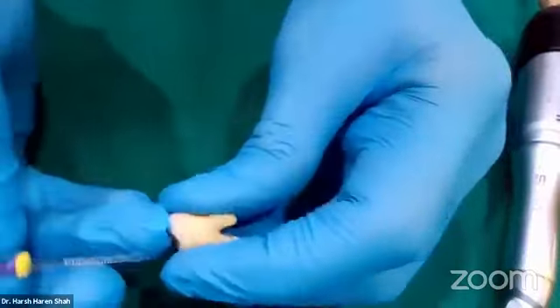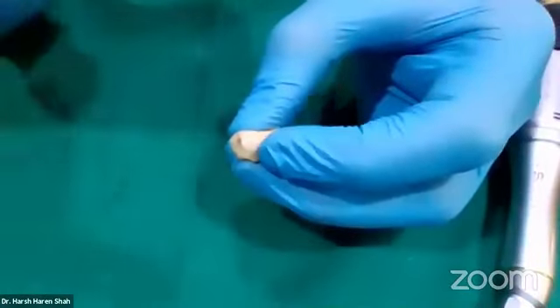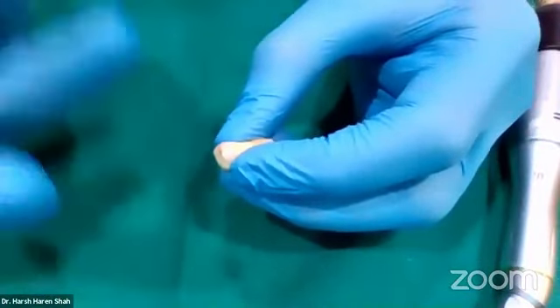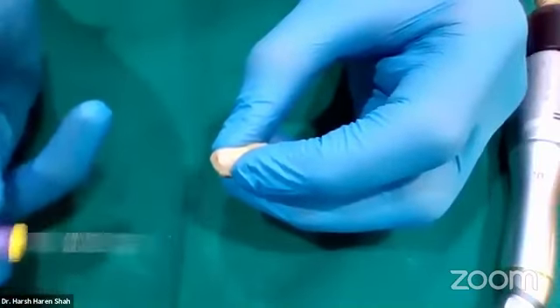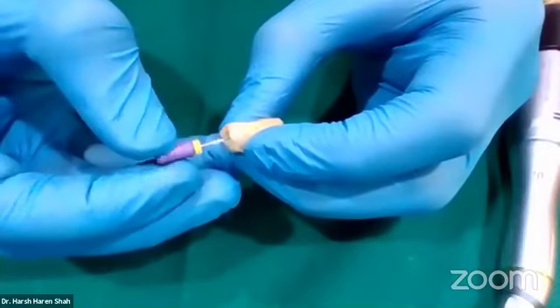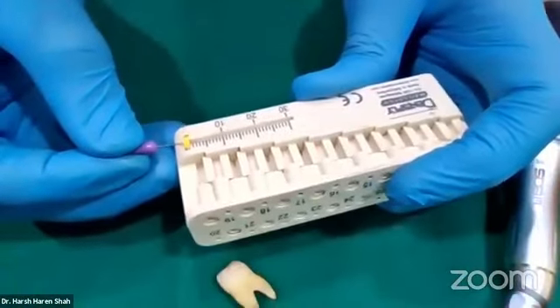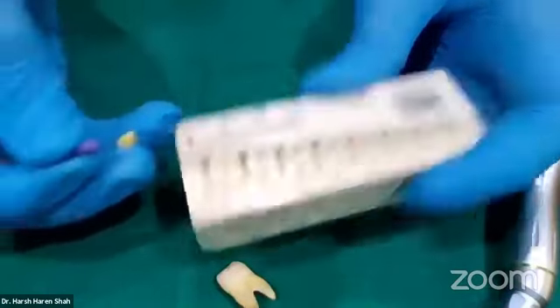Let me go back. Okay, now for this technique, we'll take the mesiobuccal canal. In this mesiobuccal canal, my orifice widening is already done. I will irrigate, I will determine the working length, and then I will take a manual 10 number K file first. I am introducing this K file into the canal and here I feel a little bit of a stop. So I will adjust my stopper here and measure what length this is. On my block, the length that I get is again 15 millimeters.